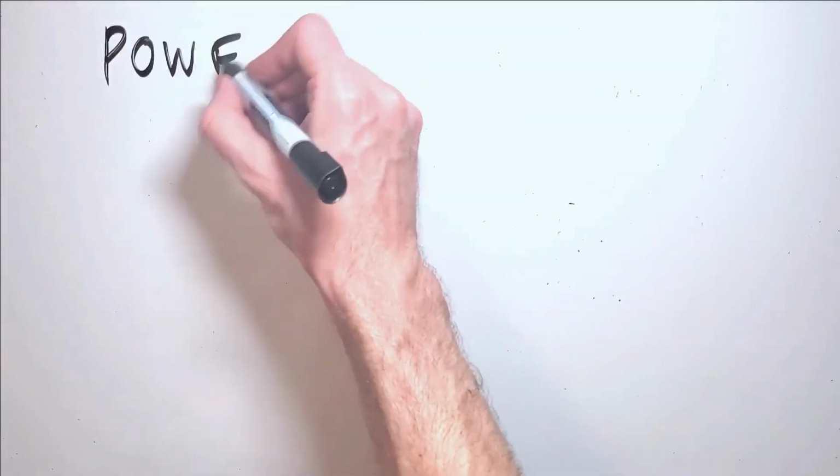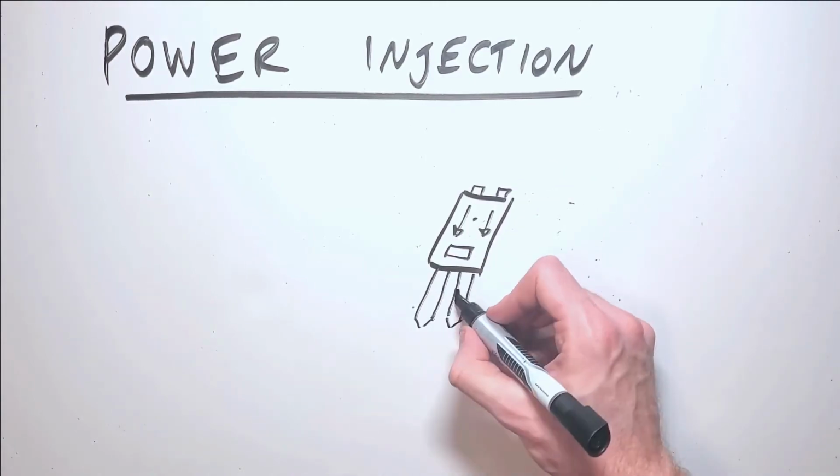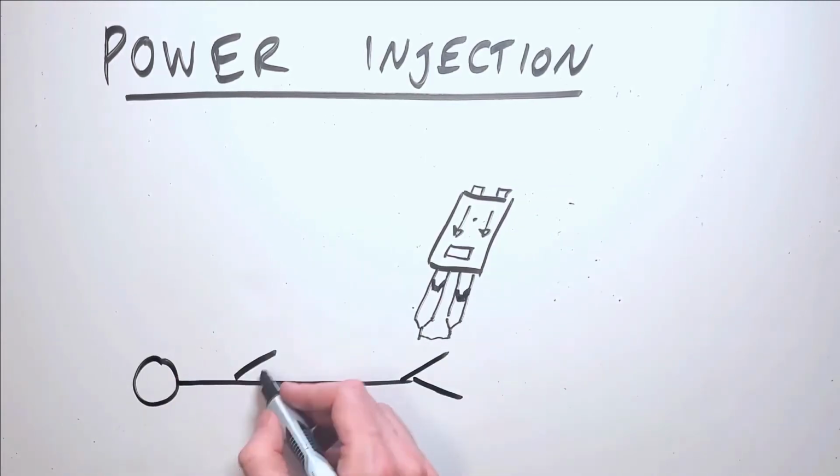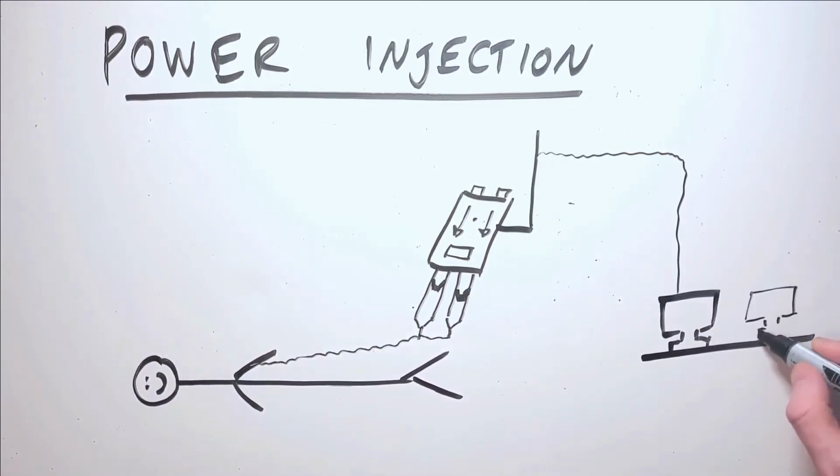Intravenous contrast is normally injected with a power injector. The power injector is a machine designed to inject IV contrast at a rapid and constant rate to introduce a bolus of contrast into the patient's vascular system in a short period of time.